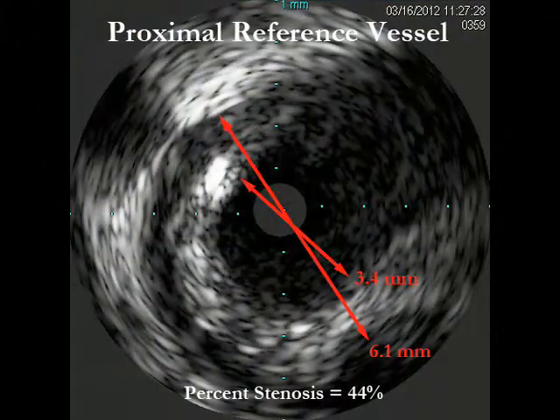During sheath removal, it is important to monitor the patient's vital signs closely, as vasovagal reactions manifesting as hypotension and/or bradycardia may occur. If hypotension is observed during sheath removal, this can typically be remedied by small boluses of IV fluid. If bradycardia is observed during sheath removal, this can typically be remedied by small doses of IV atropine.